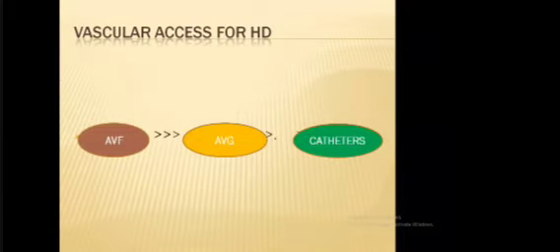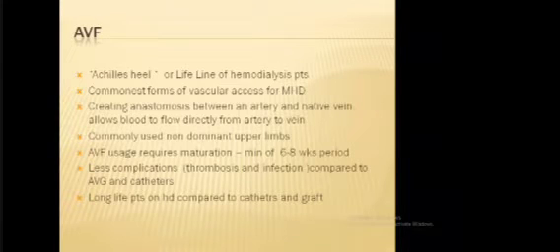So the first preference is AVF, followed by graft, and catheters are the last option. So what is AVF? AVF is the Achilles heel or lifeline for the hemodialysis patient. It is the commonest form of vascular access for maintaining hemodialysis.